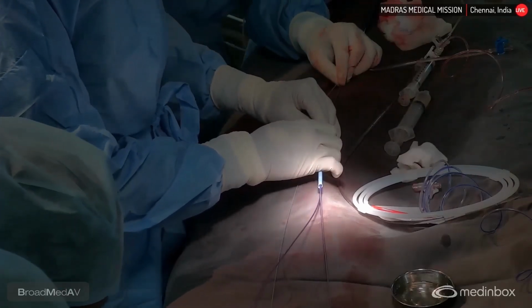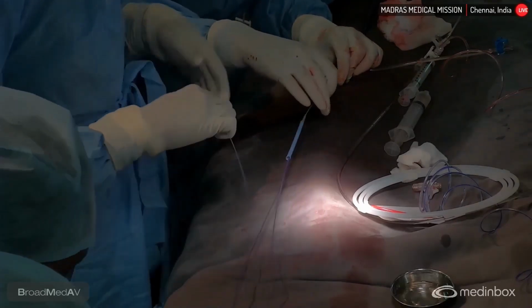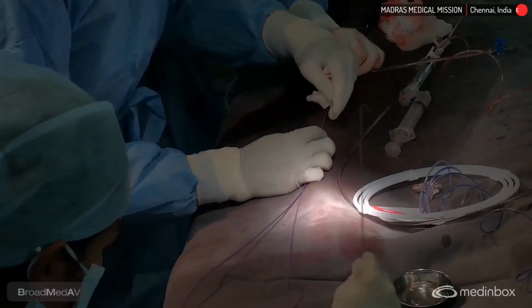Wire has come out. The second will go through the second balloon.